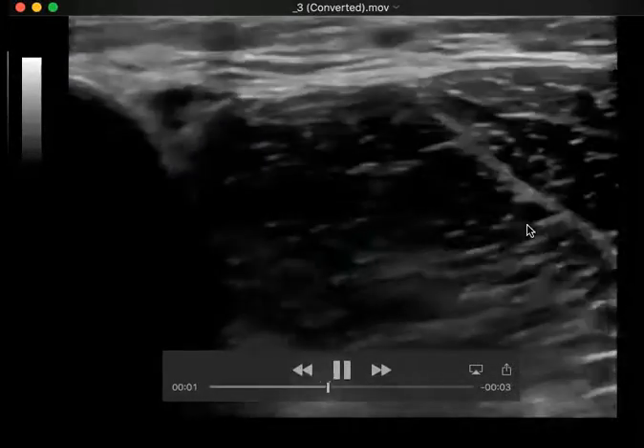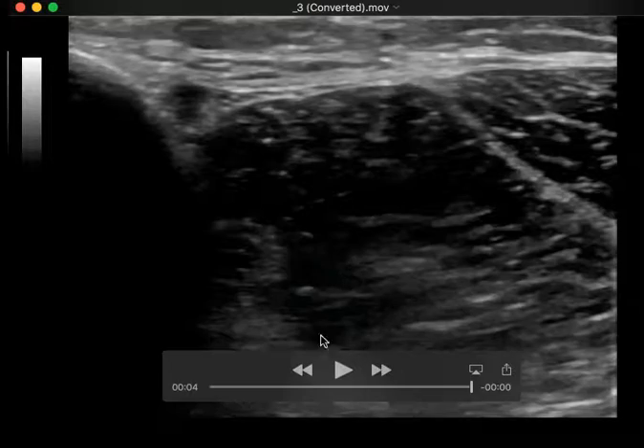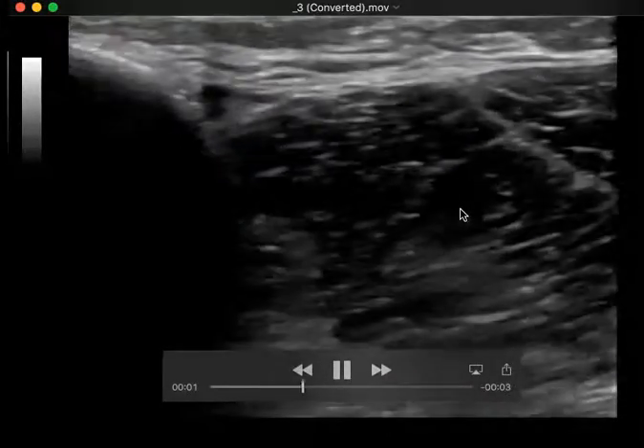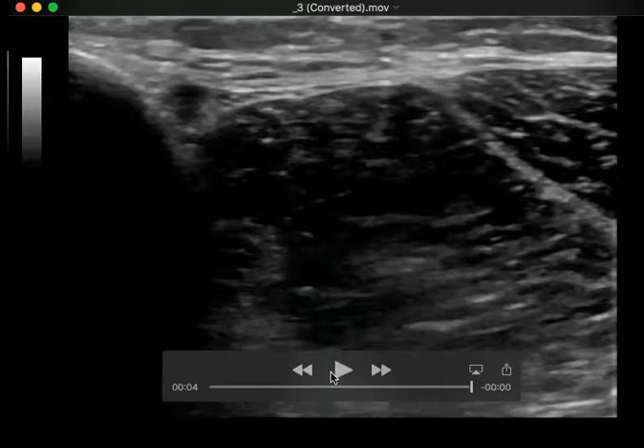This is an ultrasound to evaluate for a blood clot. You can see the provider is compressing the vessel here, which is a vein, and it collapses completely, indicating that there is no blood clot at this location at this vessel.